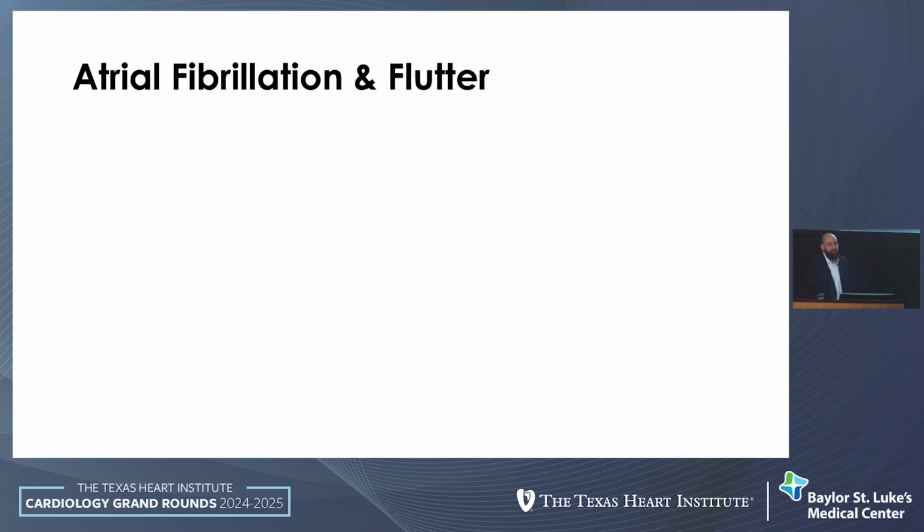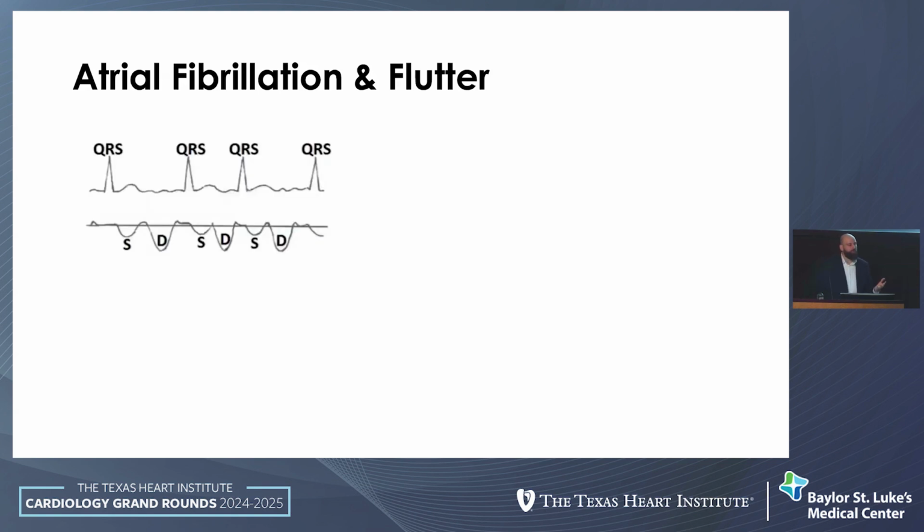Atrial fibrillation and atrial flutter. Remember, hepatic veins are a window to the right heart, and the atria play a very important role. We know the importance of AV synchrony. Here, for example, you've lost your atrial kick. What have you noticed with the S wave? The S wave has become much smaller. It's diminished. Why? Because without that atrial kick, it doesn't augment the systolic flow.